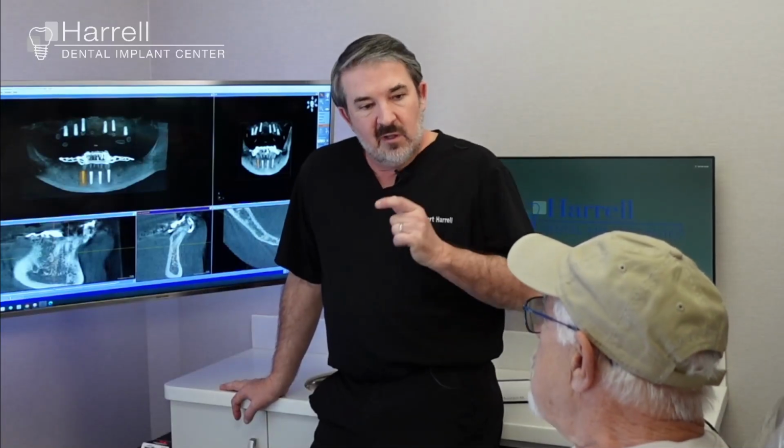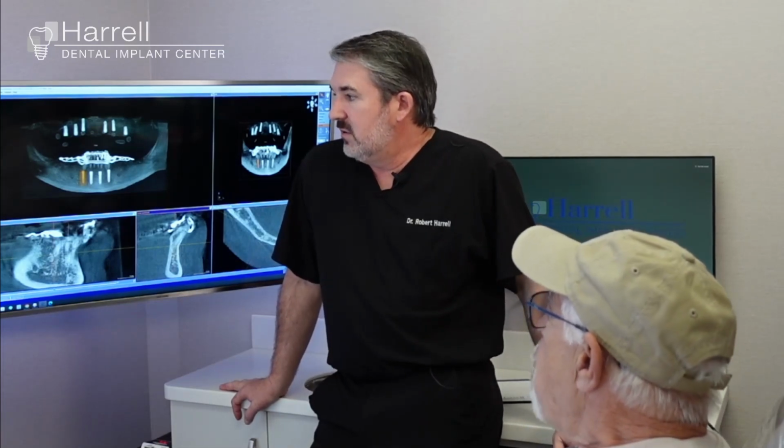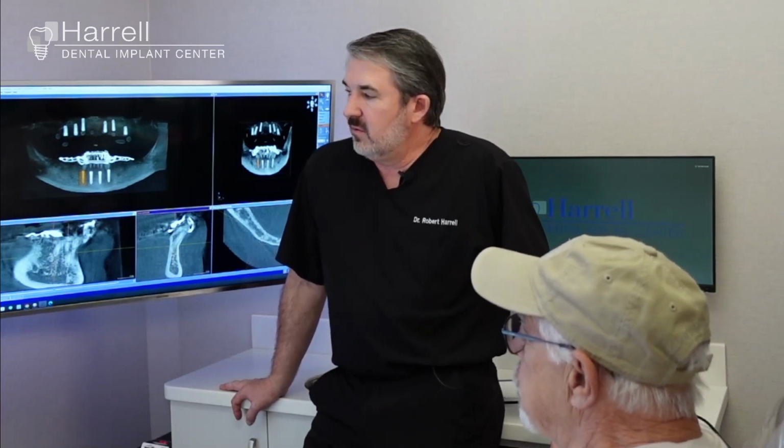Implants come in different sizes, kind of like wood screws would. If we went to Lowe's or Home Depot and picked out some wood screws and we said we really want this deck to hold up well, we'd get some really long lag screws, wider the better. Same kind of deal with implants, but you've got some good substantial bone, so I don't foresee any concerns with soft bone or anything like that.